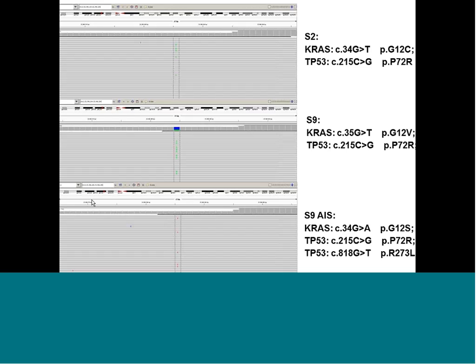So what we did, we analyzed our gene panel and found that every tumor in segment 2 and segment 9, and also a small adenocarcinoma in situ, which was not diagnosed previously, had its individual molecular signature. So we had actually a patient with 3 different very small tumors, and all were surgically removed because this patient is now not a T4 stage patient, but a T1A with 2 tumors, multiple tumors.